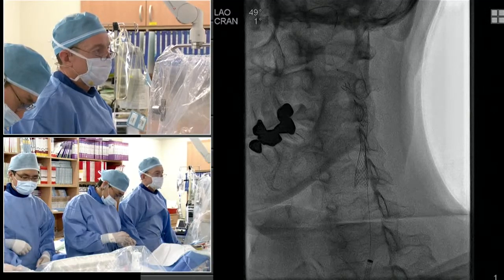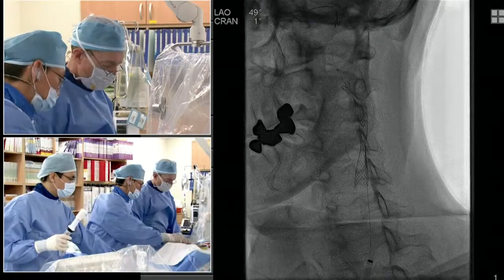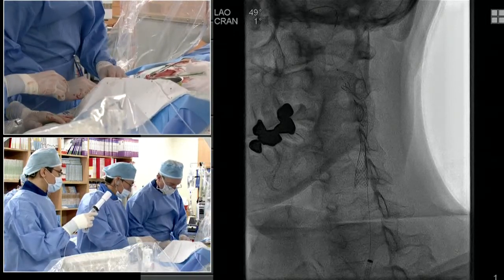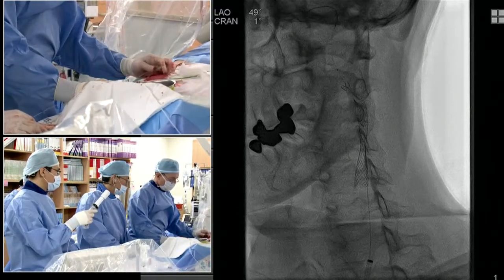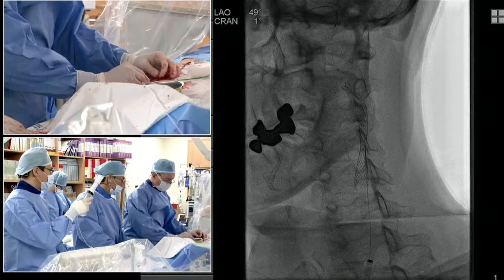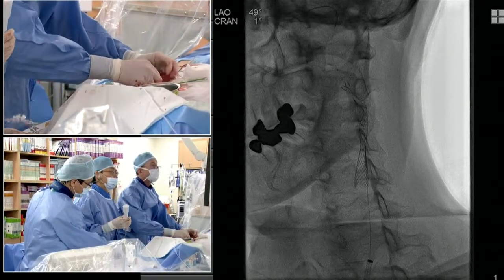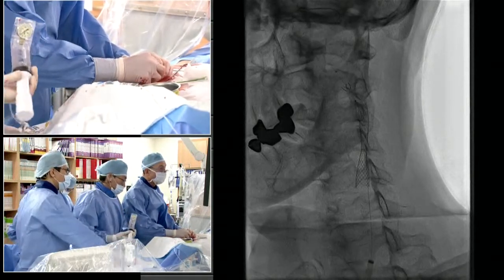How about post-dilatation? Should we bother? Yeah, I think with the wall stent, most often you have to post-dilate. We are using, as I said earlier, bigger balloons initially now, and then we usually don't post-dilate. But with the wall stent, the self-expanding force is usually not enough. Post-dilation does pose a higher risk of stroke, but in this case, you have a waist, so risk of restenosis may be higher. I think probably a good idea.